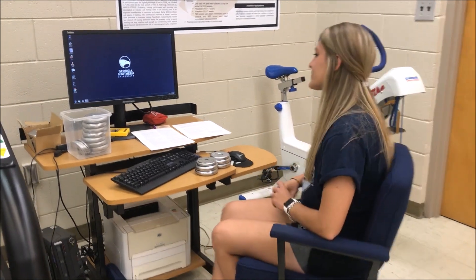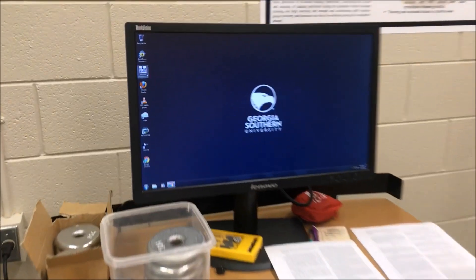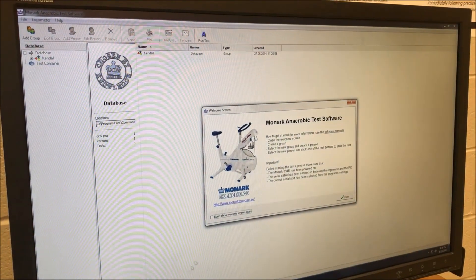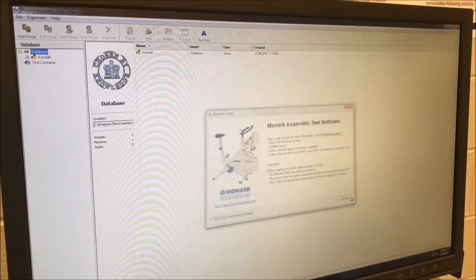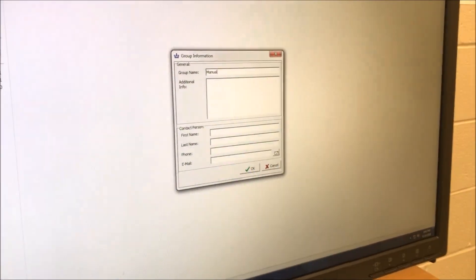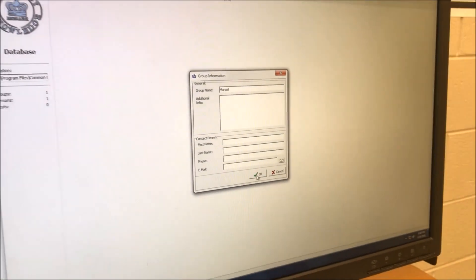To begin the Wingate anaerobic test, you'll need to log into the computer using the login provided by your affiliation. From the main screen, I'll select Monarch anaerobic test software. A screen like this should pop up. I will close out of this and go ahead and add a group. For the sake of this manual, I'm going to label this group 'Manual.'